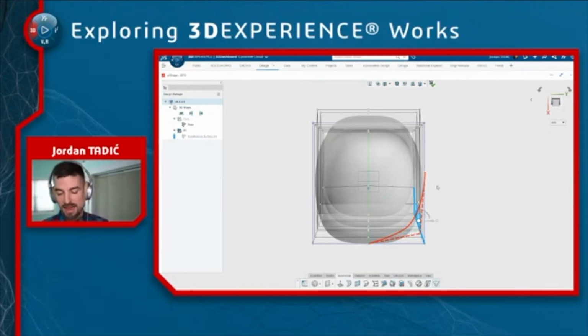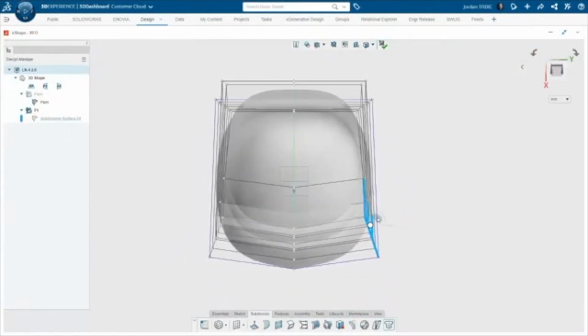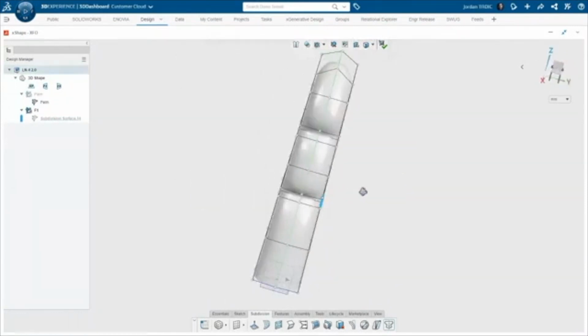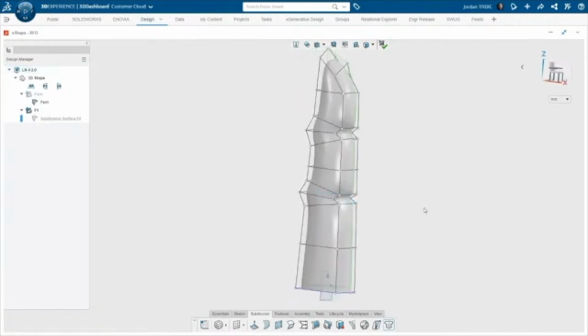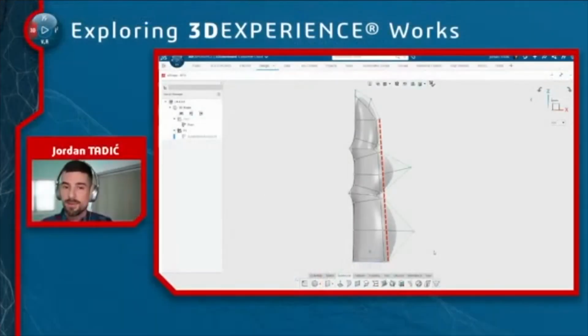So that's exactly what I'm going to do with this model, just grab onto my robot. And you can see that the style spline, or the cage around the geometry, would also very easily indicate to you if there's ever an inflection point in your curvature, especially an unwanted one. At the end of my design process, I always turn the cage on just to make sure everything's looking right and that I don't have a concave versus convex scenario going on with my cage unexpectedly, and I can correct that after the fact.